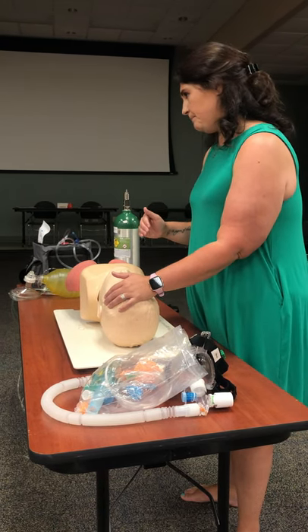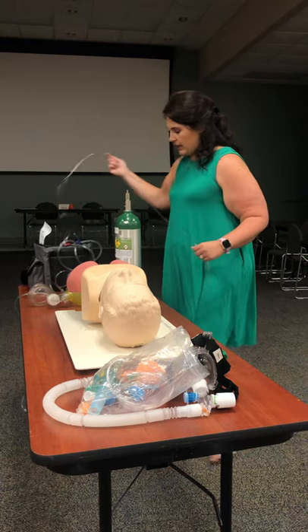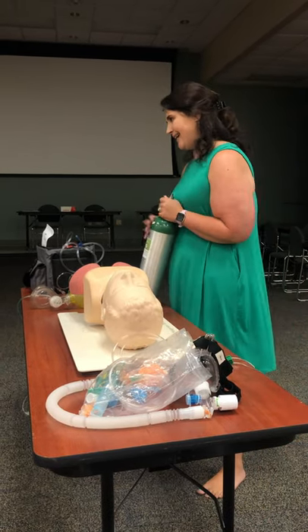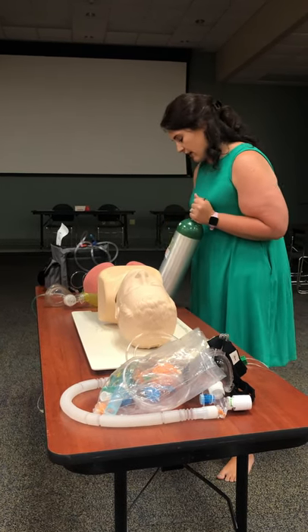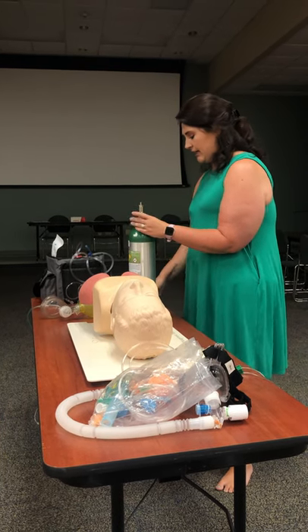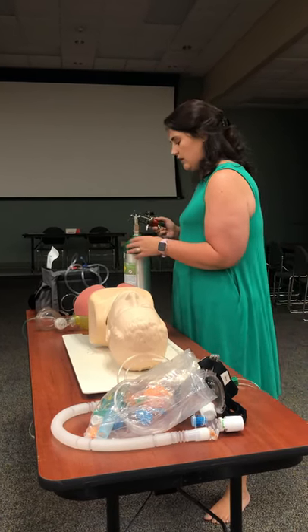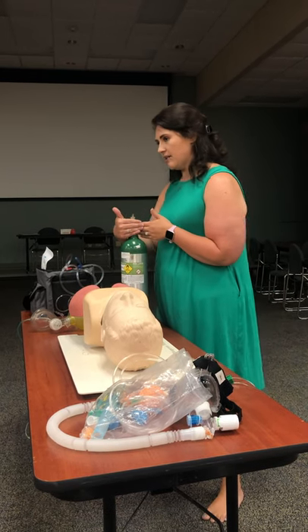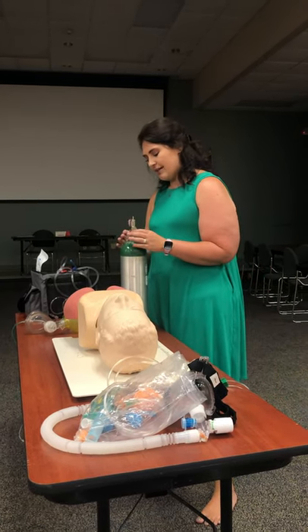Now we're going to look at oxygen administration devices. The first is the nasal cannula. I need my oxygen tank set up, and I need to know this is medical oxygen — I can identify that a couple of ways. The tank is green, which usually identifies medical oxygen, and it may also have a label. It fits the pin index system we talked about earlier, so this regulator should only fit an oxygen tank.